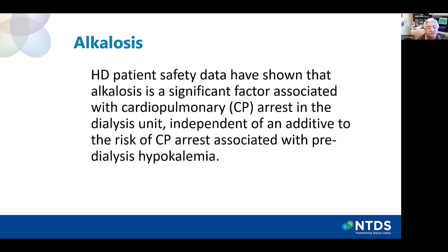A Fresenius Medical Care alert dated August 27, 2012 reported that recent analysis performed using FMCNA hemodialysis patient safety data confirms that alkalosis is a significant risk factor associated with cardiopulmonary arrest in the dialysis unit, independent of and additive to the risk of cardiopulmonary arrest associated with pre-dialysis hypokalemia.